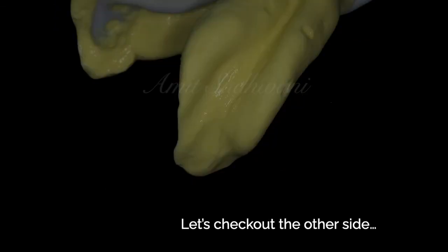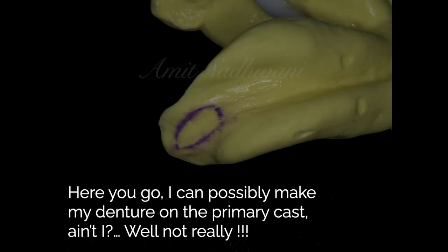Let's check out the other side. Again, we have marked it on the other side. Well, can I possibly make my denture on the primary cast? Well, not really. This particular impression was a well-made impression. It had rolled borders. It covered all the essential features of the lower arch foundation.